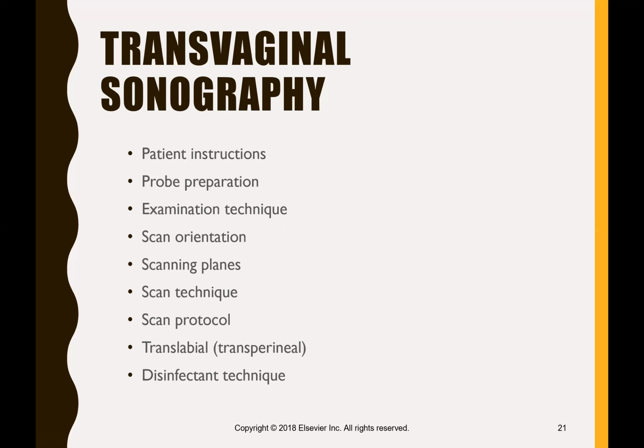I personally love the transvaginal ultrasounds because I feel like I can see so much more clearly, because you're closer to the uterus and you're not having to deal with different layers of the patient, like the fat and the muscle. So it's just a better view. You'll have the patient empty their bladder for this.